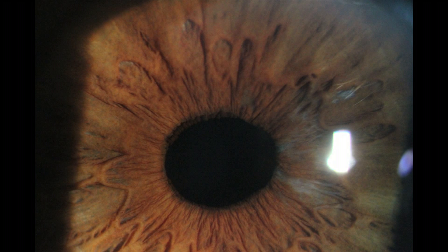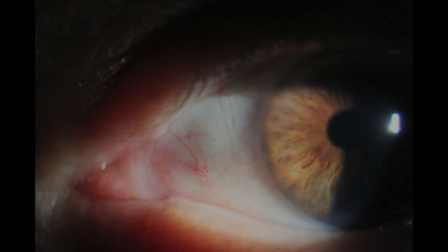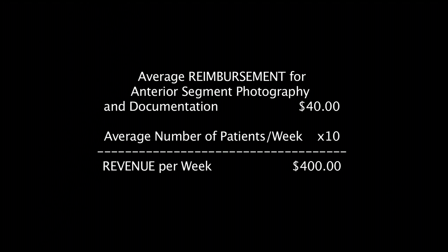Here are some sample images captured with the iMacam SLR digital slit lamp system. And here is the billing information for anterior ocular photography.